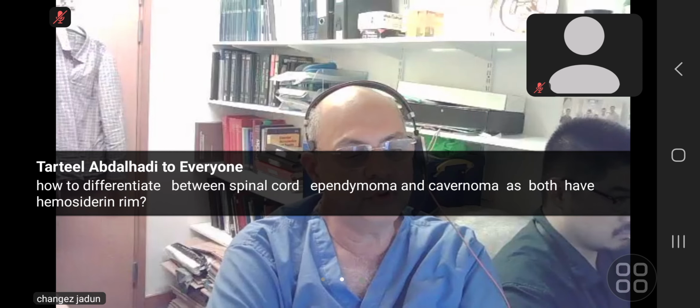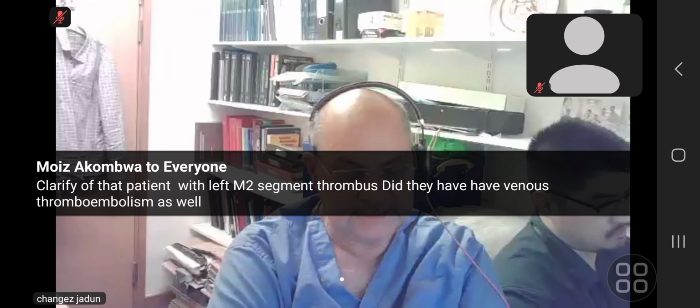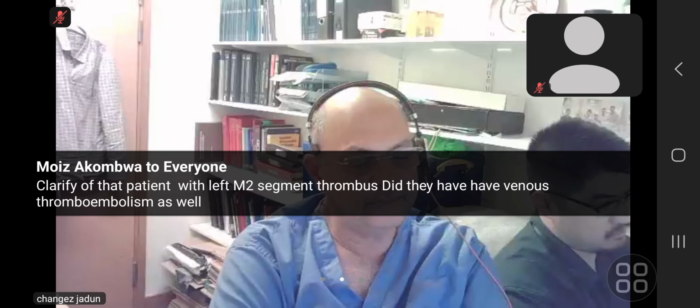In this case that I showed, the occipital lobe was involved bilaterally, mostly left hemispheric, and a bit of the caudate nucleus was involved. The most important thing tagged with this finding is a very specific clinical picture, and that is cognitive decline over days to weeks.